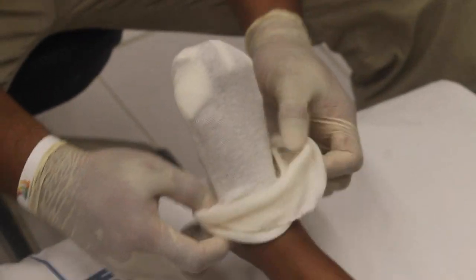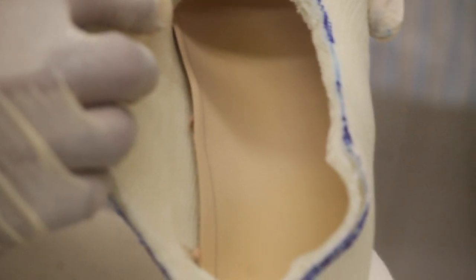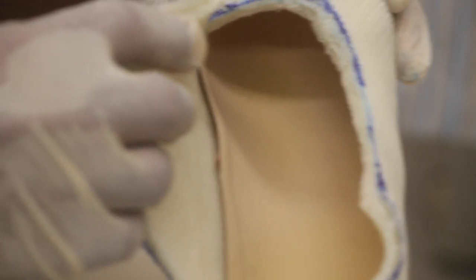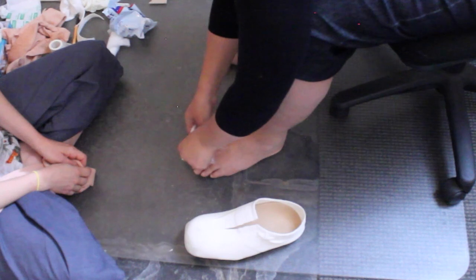Remove all stockinette and soft band. Check trim lines and inside of the shoe for any sharp edges, bumps or ridges. Remove any problem areas or cover with tape if adequate.